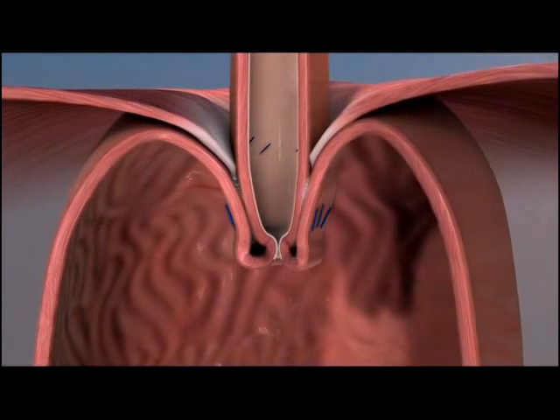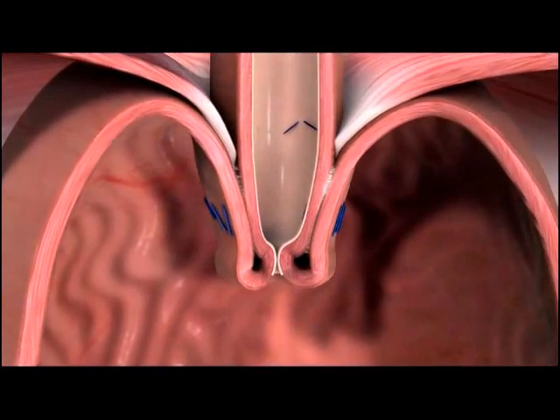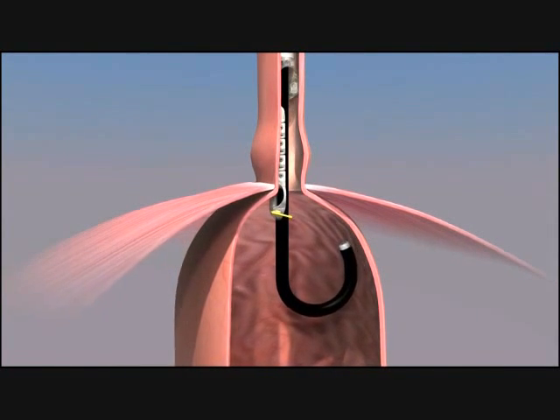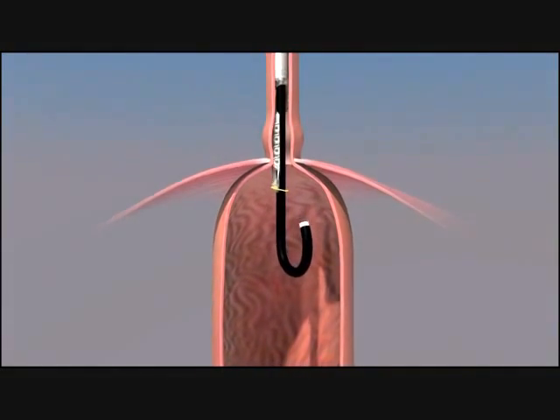Fundaplication is an incisionless surgical procedure that reconstructs the body's natural physical barrier to reflux. The stomach is inflated and the endoscope is advanced and turned so that it is looking up at the entrance to the stomach. This is where the anti-reflux valve will be created.